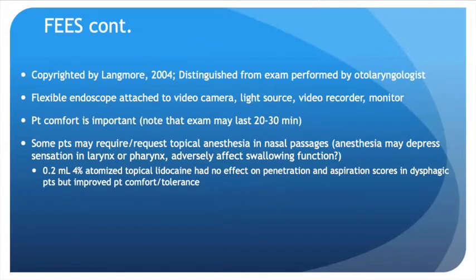Sometimes local anesthesia is provided to the nose to help with this. The exam might last 20 to 30 minutes, actually. So much longer than the modified barium swallow. So you can do more things as a result. Some patients might require or request topical anesthesia in the nasal passages. That being said, this anesthesia can depress sensation in the larynx or pharynx and can potentially adversely affect the swallowing function, although there's not great evidence of this. Typically about 0.2 milliliters of about 4% atomized topical lidocaine is used. And this is shown to have no effect on penetration and aspiration scores in dysphagic patients and improved comfort and tolerance.